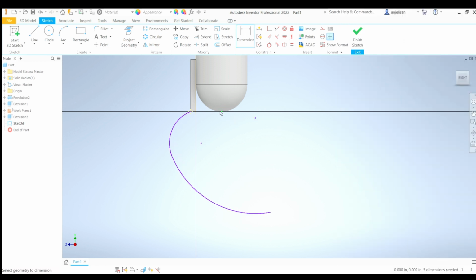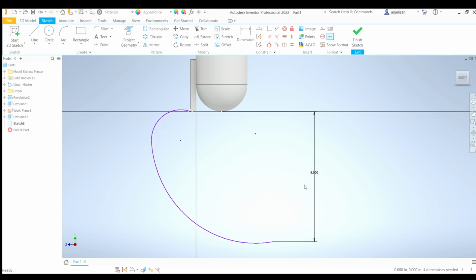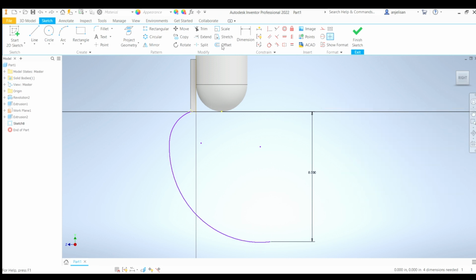Let's see. Let's dimension from this little point to this little point at the end of the arc, and again it's 8 inches. So that looks pretty good. So I'm just going to adjust it a little bit, and just be a little careful, because again, it's not exactly the lowest point of the arc.